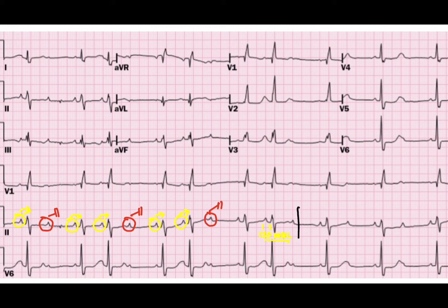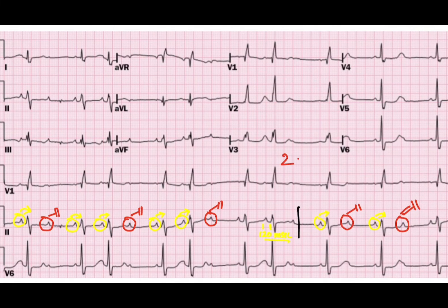So up to this point it is second degree type 2 heart block. But what about this part now? This P wave conducts, this one blocks. This P wave conducts, this one blocks again. Here, the type 2 heart block has converted to high degree AV block — that is 2-to-1 AV block, where for every 2 P waves only one conducts to the ventricles and the other is blocked.